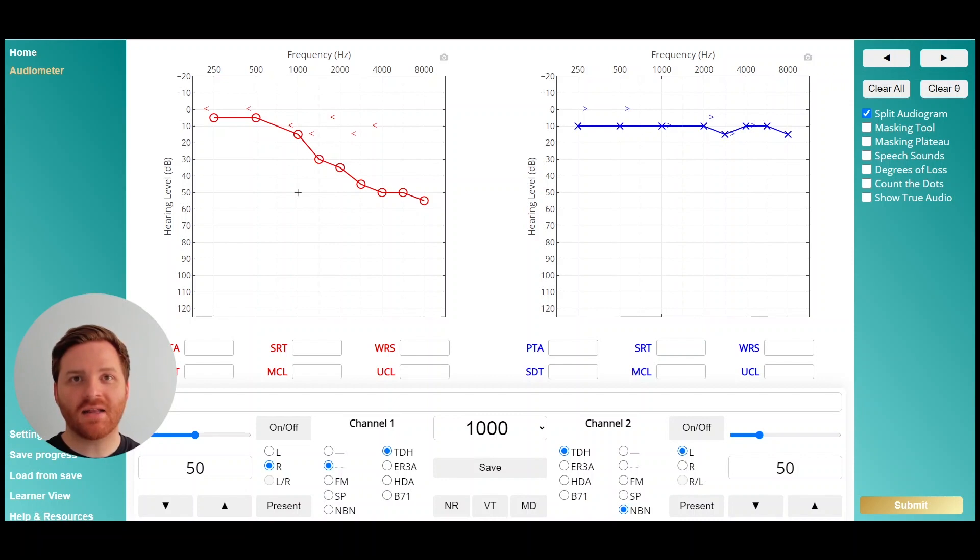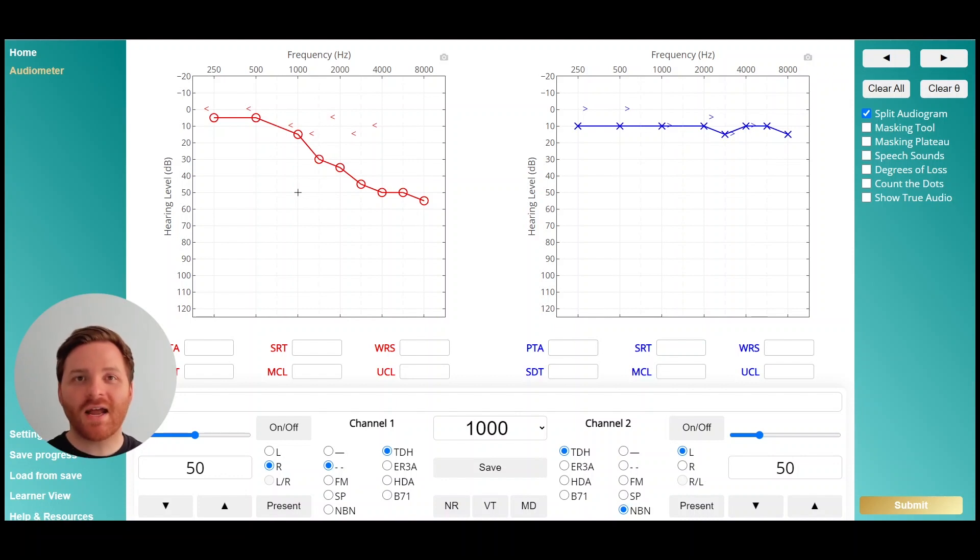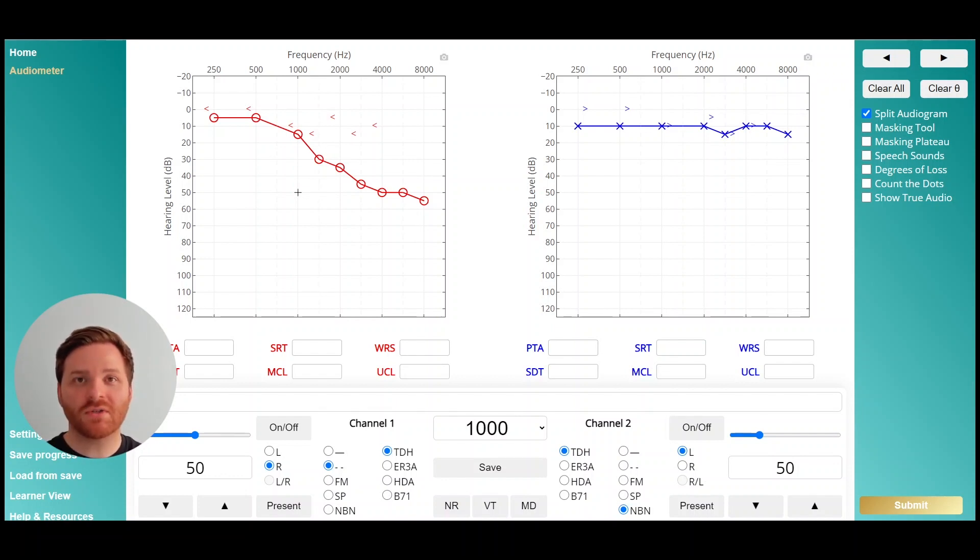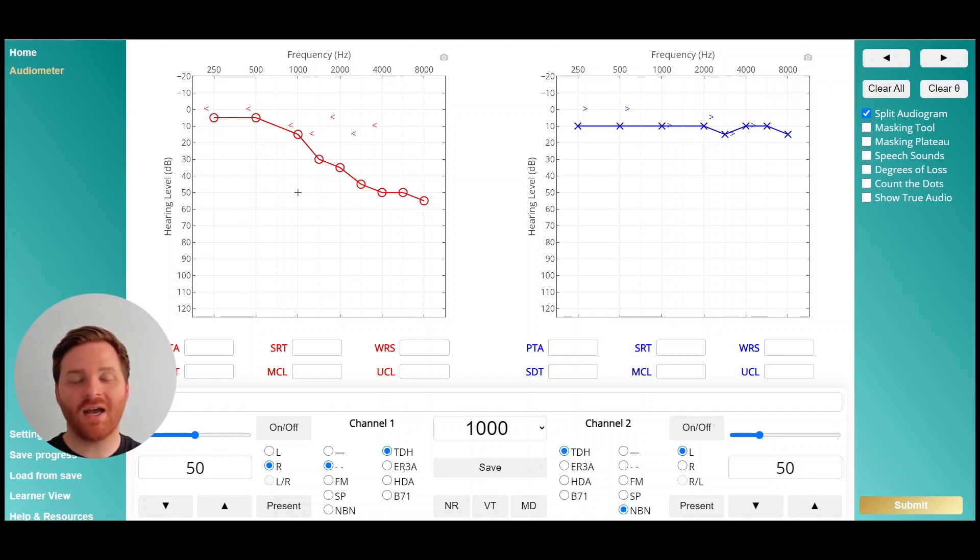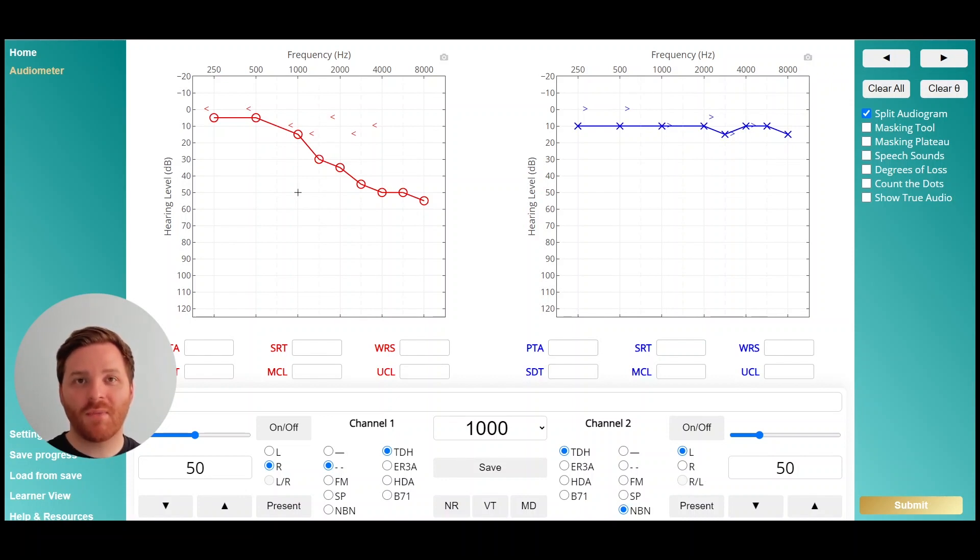I've gone ahead and designed this audiogram in Theta and I've pre-filled in all of the unmasked thresholds. There's a neat little setting that allows you to automatically generate the unmasked thresholds so you can focus on learning when to mask and how to mask without having to fill in the unmasked thresholds all the time. Watch the video linked below for more information on how to use that setting.